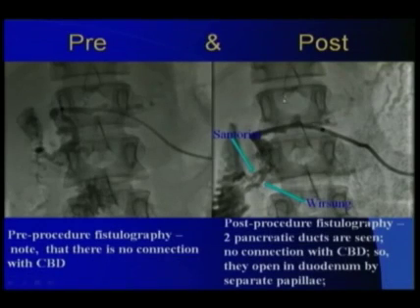So this is the pre- and post-procedure picture. The Wirsung duct contains the stones here, and this is its connection with the duodenum. But after the procedure, we start seeing another duct, which is also connected with the duodenum. Actually, we made the dilation and the Wirsungolitholapaxy procedure using this duct, which is probably the Wirsung duct, and this is the Santorini, the accessory pancreatic duct.